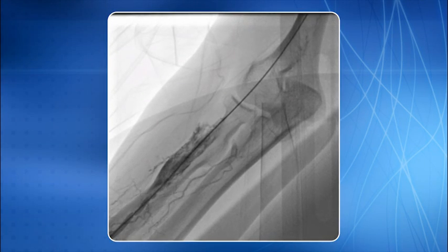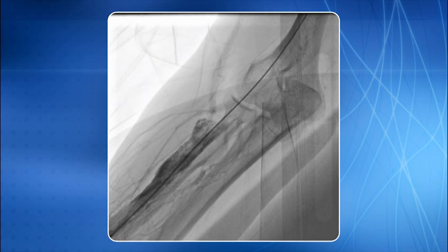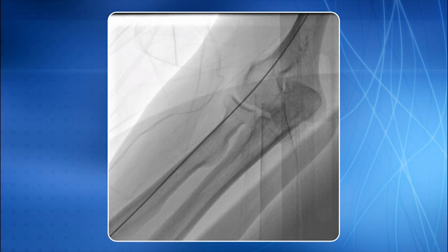This is another example of perforation which was dealt with using the same technique. This is one more example of perforation. You can see extravasation, and it was tackled in the same manner. This is another example. I showed you several examples of the technique dealing with the radial brachial perforation. The technique to deal with perforation developed by us is not only effective but also reproducible.